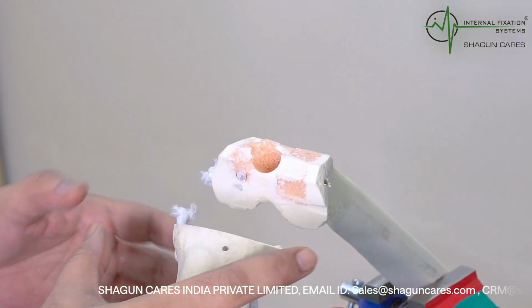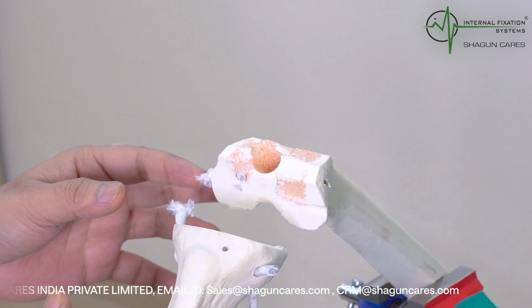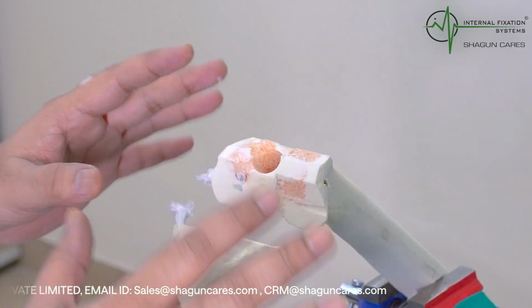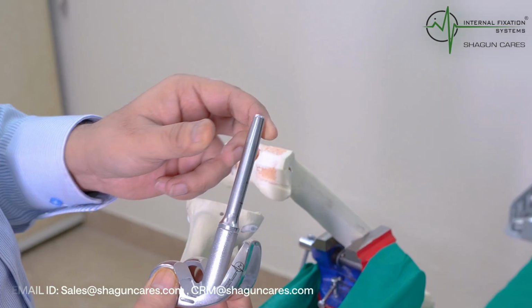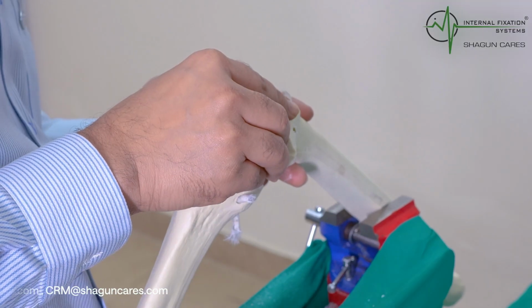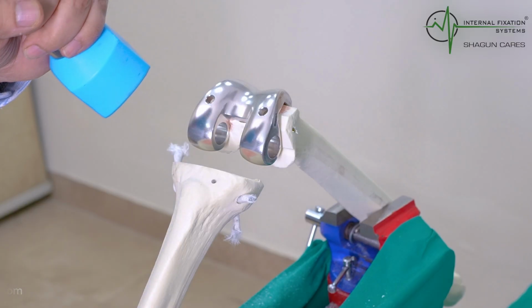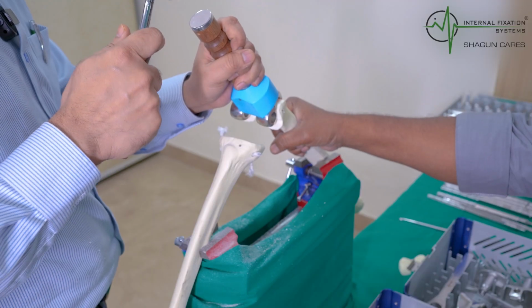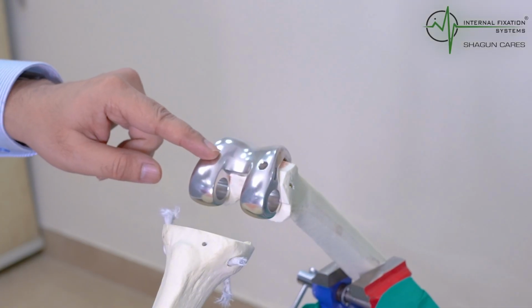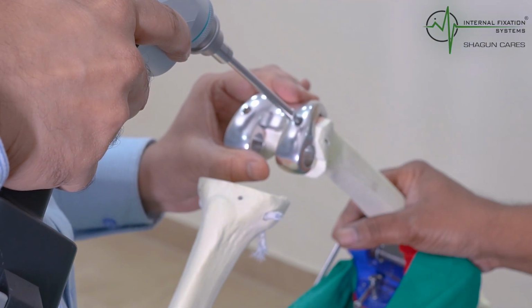If you see, the knee is like this, you don't have ACL, PCL, everything you have cut. So you need a prosthesis which fits well in both the systems. And now we are going to use this. We need to punch it. We also have two pegs to give extra stability, the rotational stability.